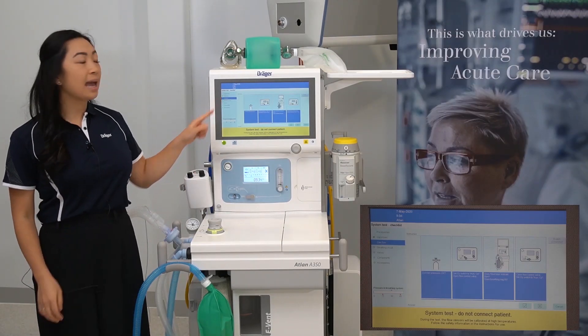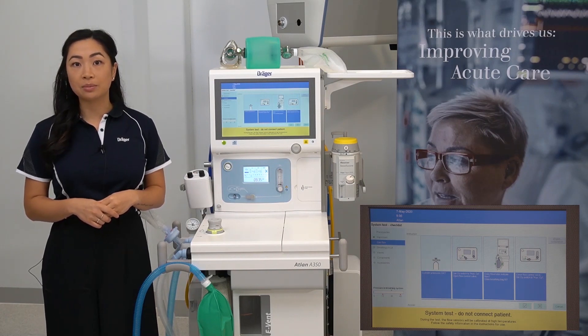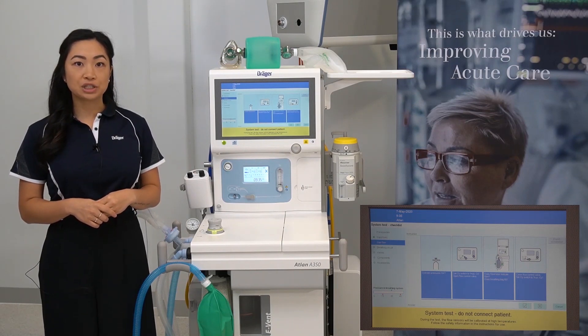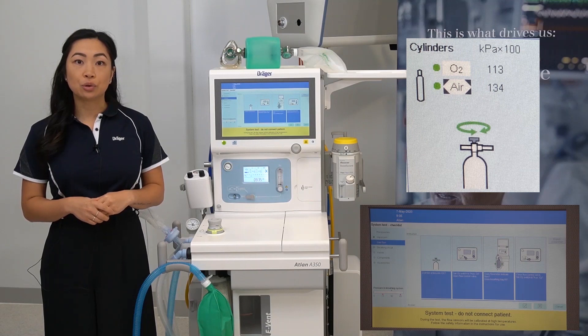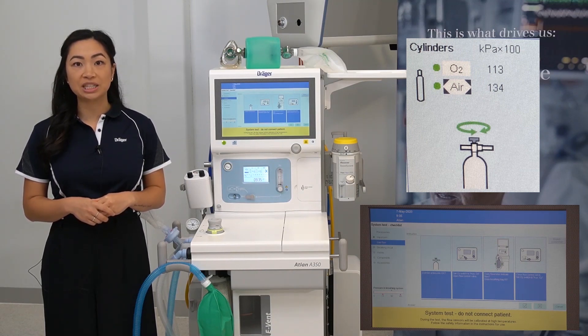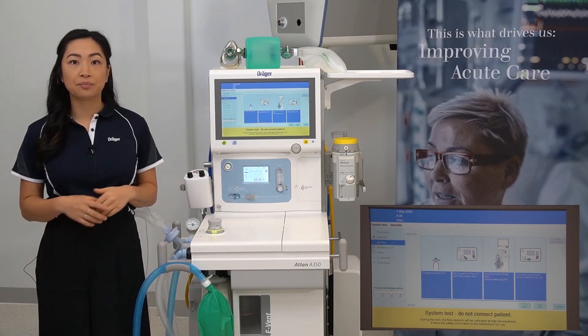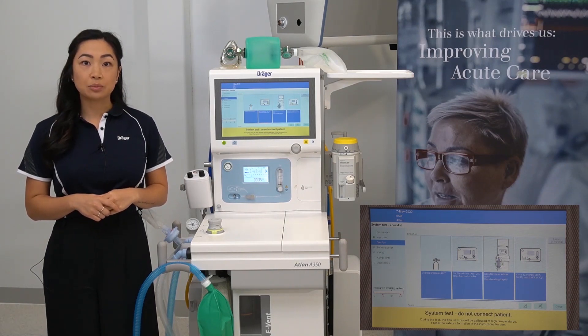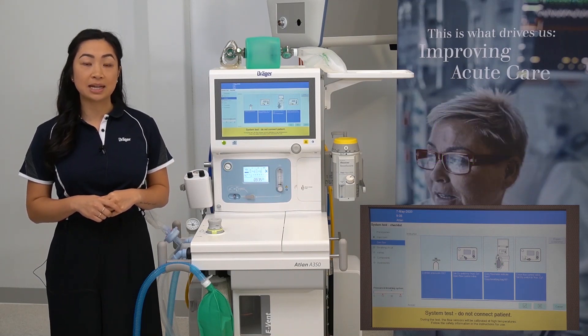Now we are looking at the gas flow. To verify your cylinder pressures are okay, you'll need to open up the valves on the reserved gas cylinders on the back of the device. Once the pressure is registered, it will be displayed on your screen here. You should also see a green color-coded dot next to each gas to indicate adequate pressure. Your cylinder symbols will ideally have four black squares which represent a full cylinder — every square represents about 25 percent.